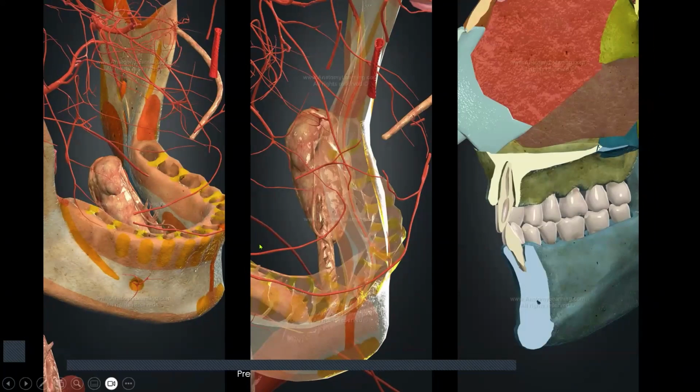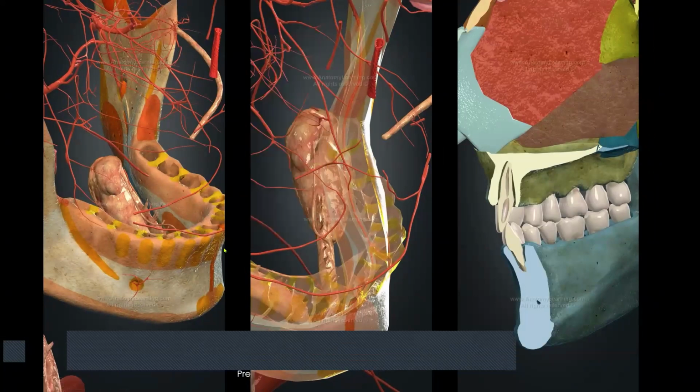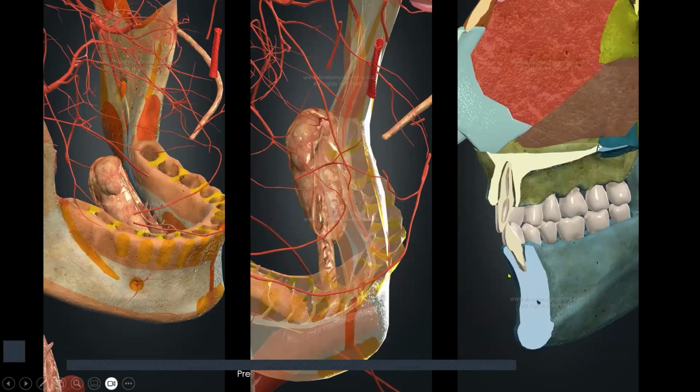And the mandible, if you see, in the mandible we have different locations. First of all, look at this picture. In the mandible anterior region, you have a very thick bone over here, and the whole bone is mostly a cortical bone in the mandible anterior region.